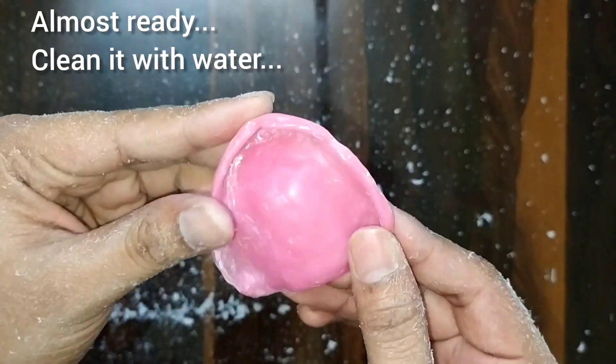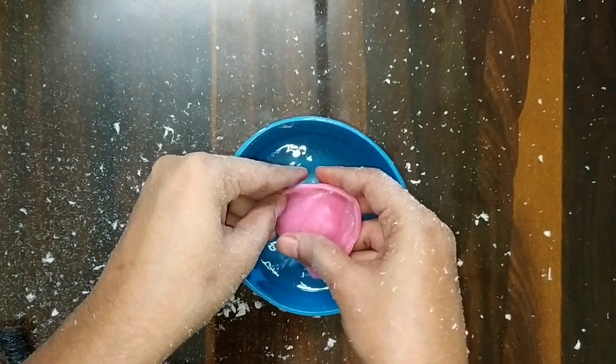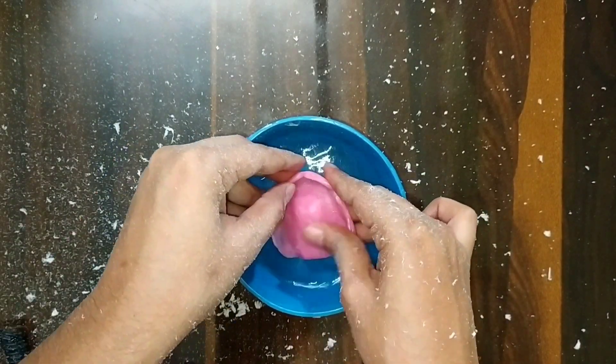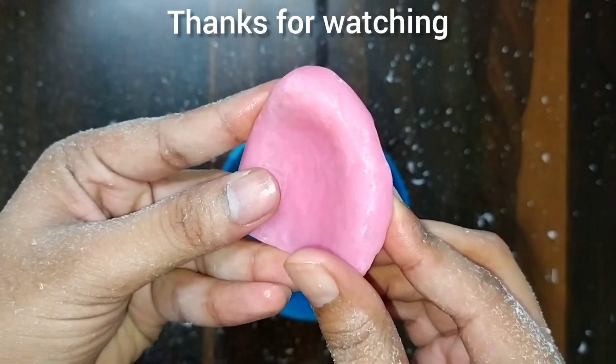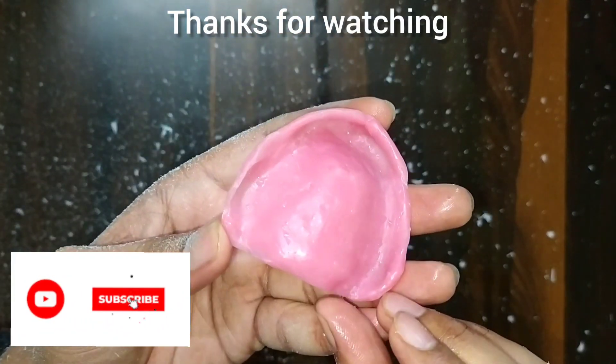We will wash it with water, and you can see our denture base is now complete. Thank you very much for watching this video — share it with your batchmates.